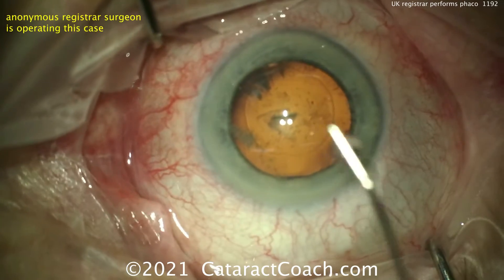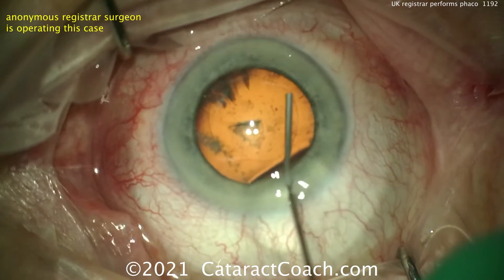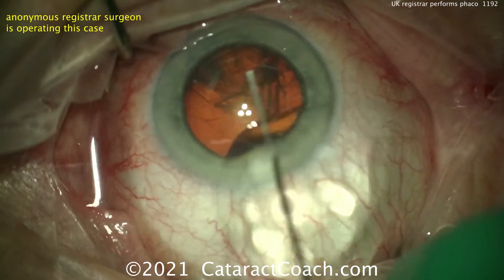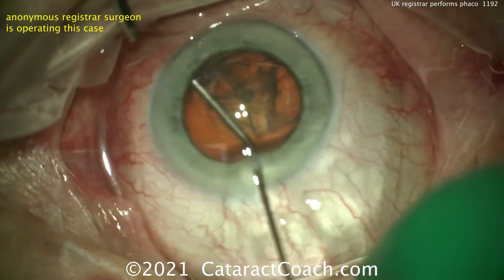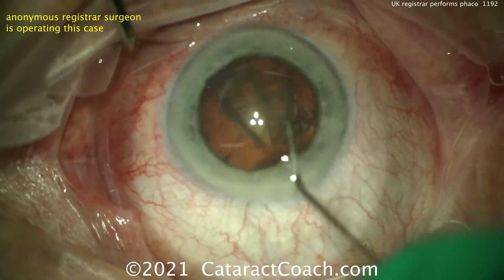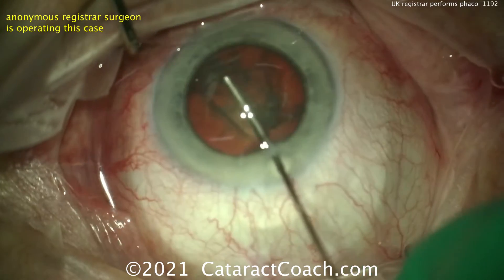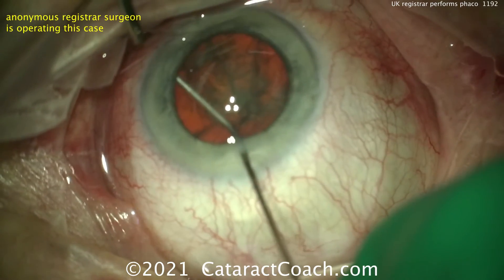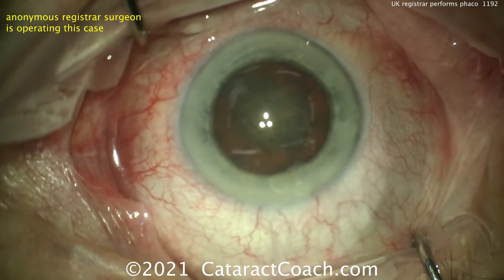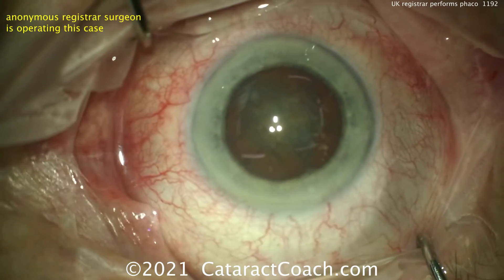You may have a little bit of trouble superiorly or sub-incisionally getting out some of that cortex because the rhexis there is a little smaller. But it looks great. Here's the hydrodissection. Notice how much viscoelastic is lost with hydrodissection — this happens to all surgeons, all cases, all eyes. This is why I like to put a little aliquot of dispersive viscoelastic against the central corneal endothelium prior to doing PHACO. Don't do a mega fill because that can predispose you to a PHACO wound burn if you're stopping fluid flow throughout the anterior segment.